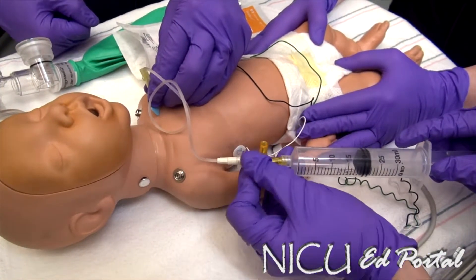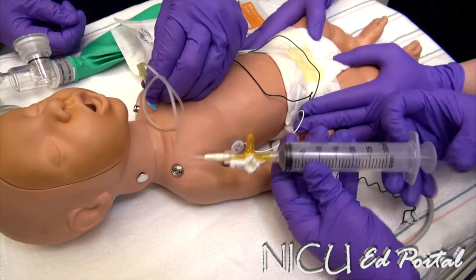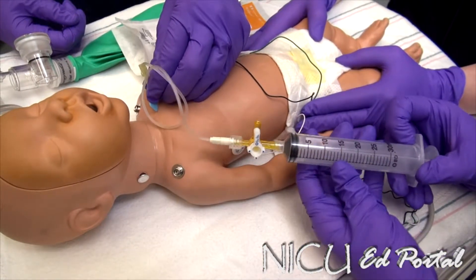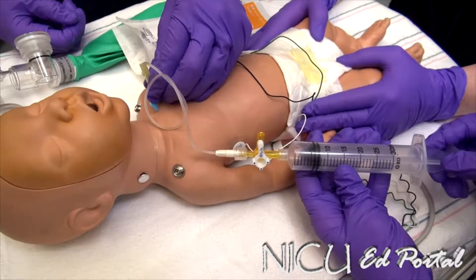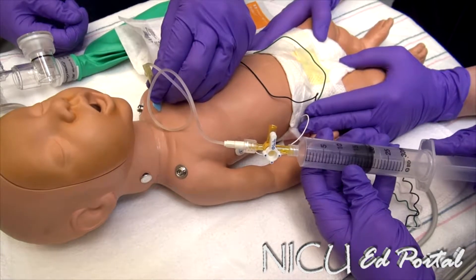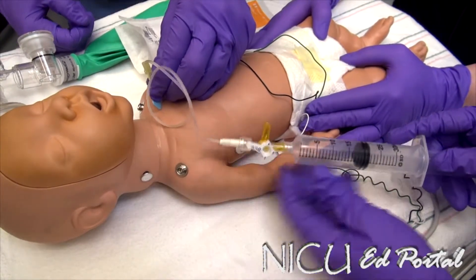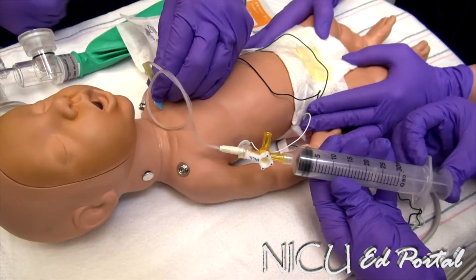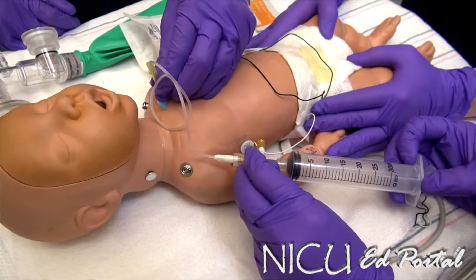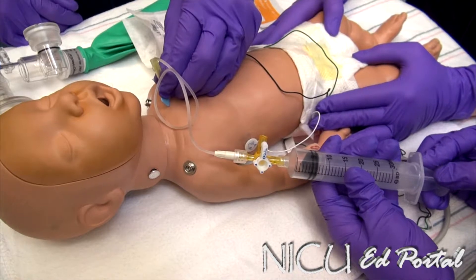20 cc's pulled off. I'll pull off 20 more cc's — let me know if you feel resistance. Starting to feel a little bit of resistance. 20 cc's. I was still able to pull some off, so a little bit more here, needing some resistance at 5 cc's.